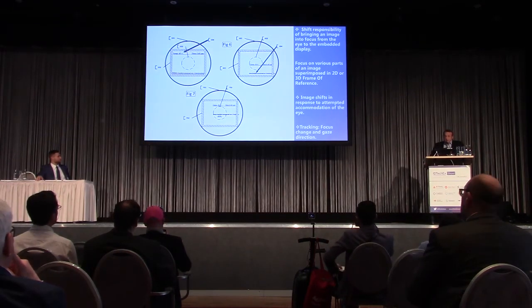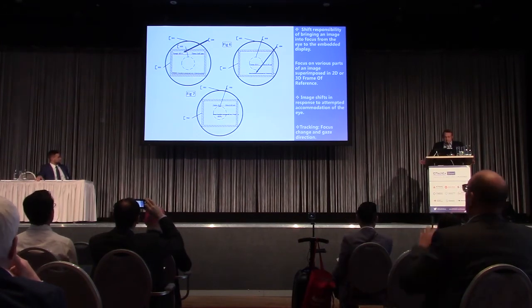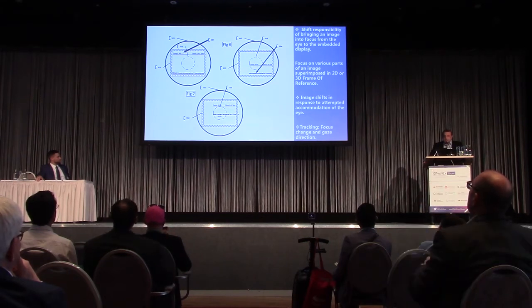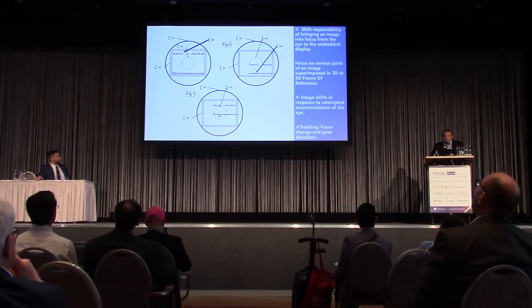So you have figure 5, in the upper left corner. 501 is the contact lens. 502 is a hypothetical rectangular display. 503 is the dashed line, which is the center of the display, the area of the display that comes in focus. The rest is going to be peripheral view, which is out of focus.